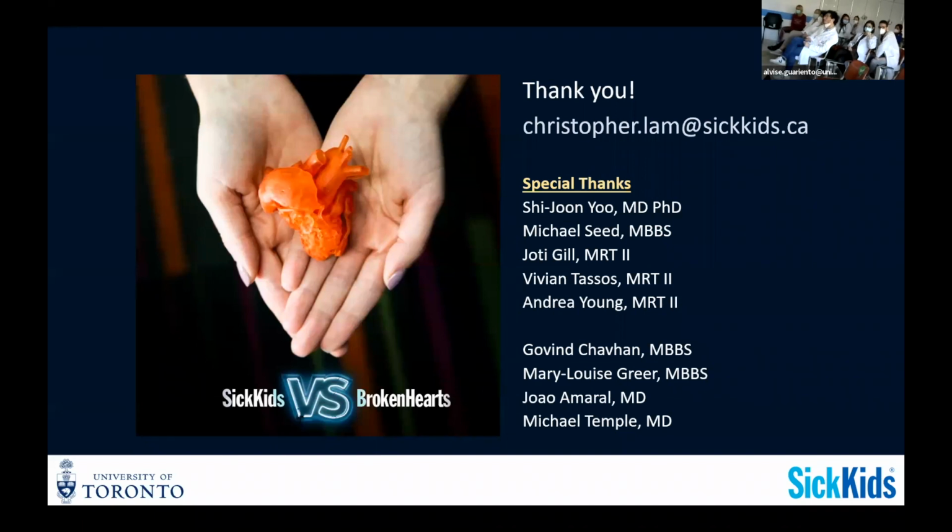Thank you very much. Beautiful lecture and great images. Very fascinating and inspiring. Just one question. For such a long exam, 4 to 6 hours, how do you cope with your patients? I guess for a Fontan failure patient, being in the magnet for 4 to 6 hours is quite long, it's difficult. Have you experienced any problem, any complication during the scan? No, we haven't had any complications. It's under anesthesia, so they're not awake. Okay, that's okay. Under anesthesia. Okay, thank you.